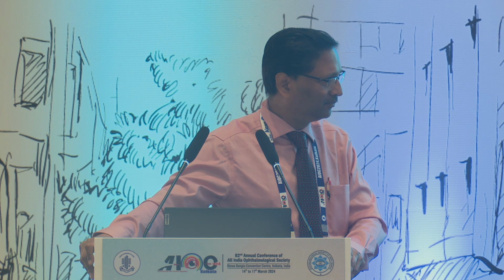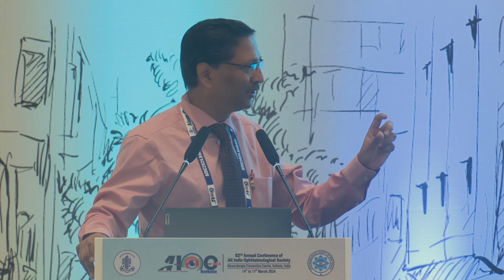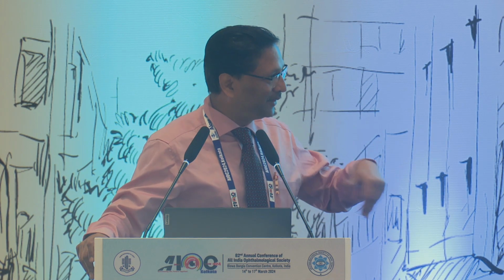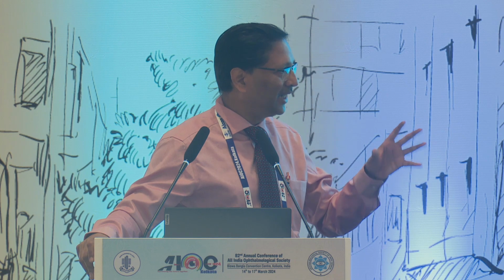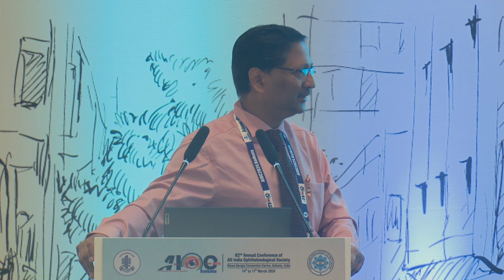Have you ever encountered the extension of the anterior capsule? No, I didn't encounter because I am doing a very small capsule rhexis initially. Baby rhexis. Then I am aspirating all the mid-peripheral cortex, decompressing it, and then I am going for the second CCC. Thank you very much, Doctor.